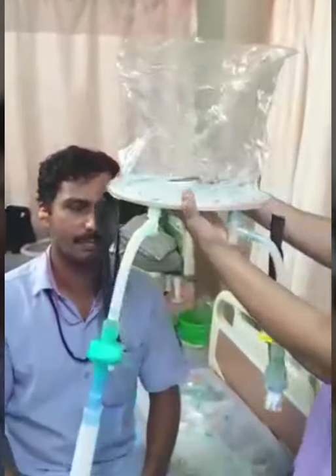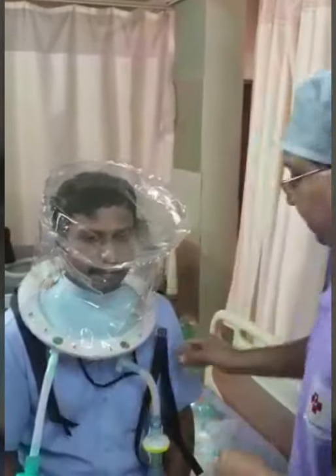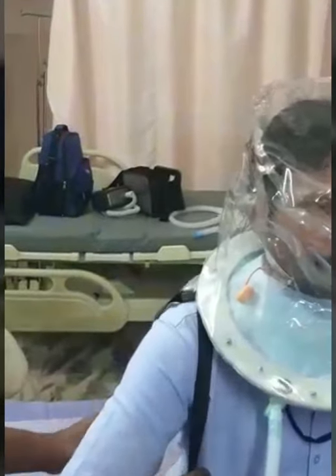Then, now it is ready for insertion. We stretch this. Before that, we have to put the ear plug on the patient because there will be positive pressure inside the hood, so that the patient doesn't feel the pressure. Then we stretch this rubber and it is set to the patient's shoulder. Then there are two straps which can be fixed to the patient like this. Now it is ready.